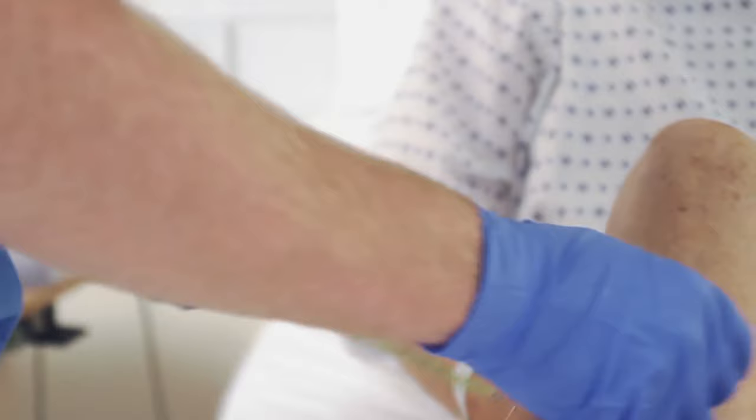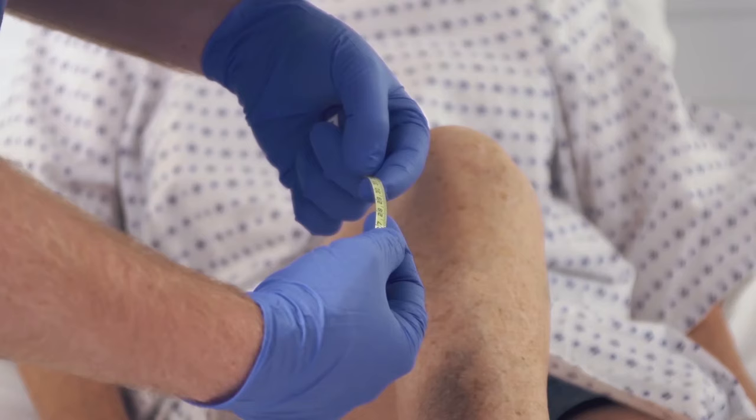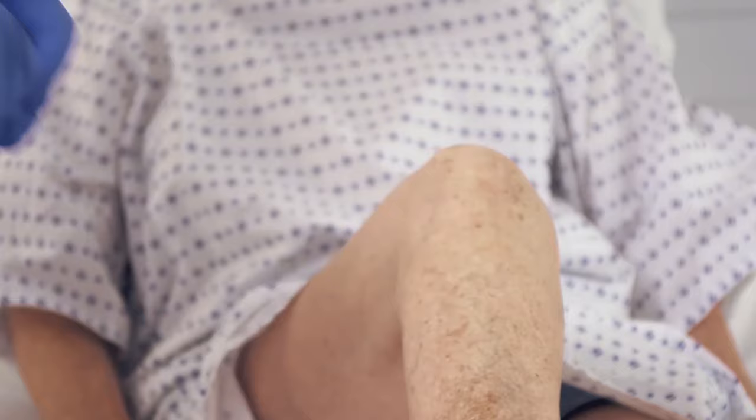The sleeves are available in thigh and knee length sizes. For knee length sleeves, measure the circumference of the patient's calf at the widest part and then refer to the Kendall SCD system sizing chart to determine the correct sleeve size.